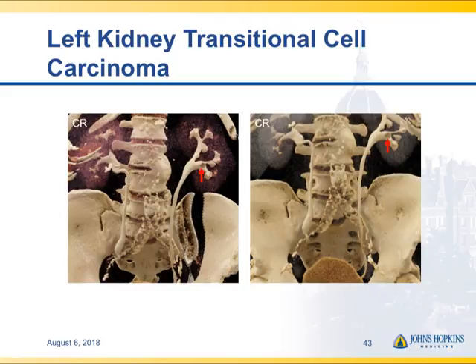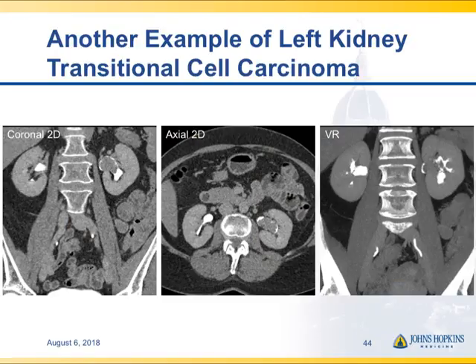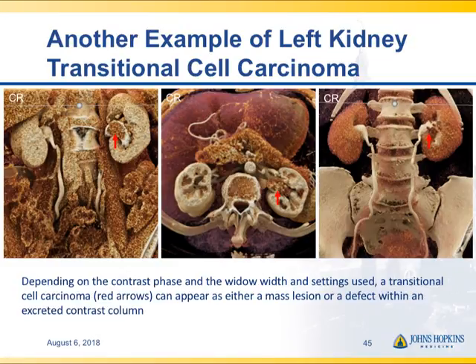Here you can see the filling defect in the patient's lower pole calyx of the left kidney — very nice visualization. Here's another case with a mass in the left renal pelvis, nicely seen. On the MIP coronal delayed phase view you can see the distortion and destruction of the renal pelvis, the calyceal changes — a very nice example of transitional cell carcinoma. On cinematic rendering you can see the soft tissue mass filling the renal pelvis, the destruction of the calyces, and the distortion of the renal pelvis on the far right image.